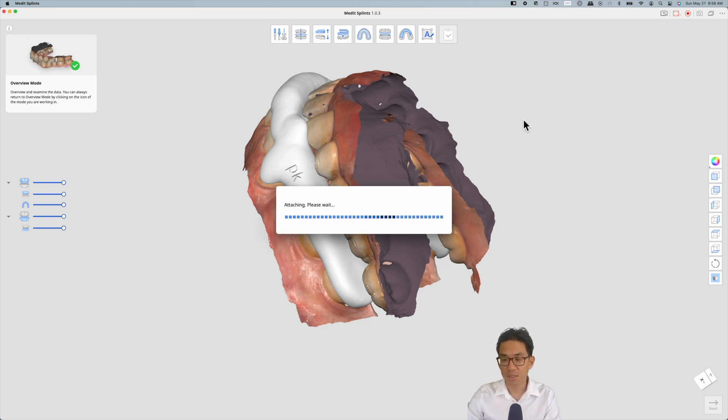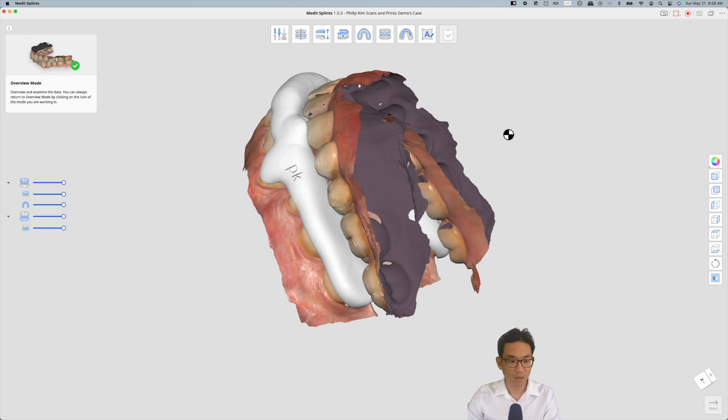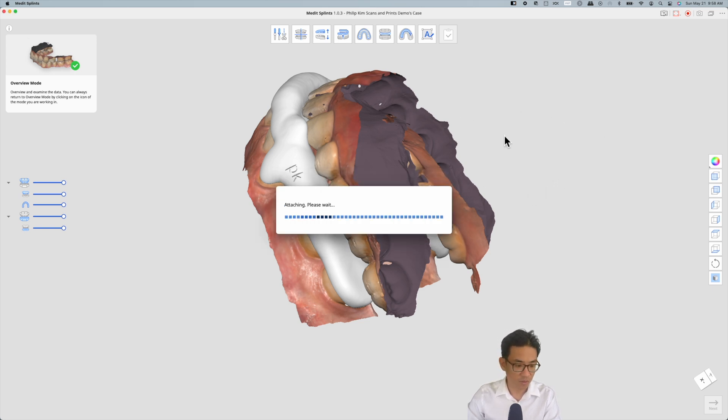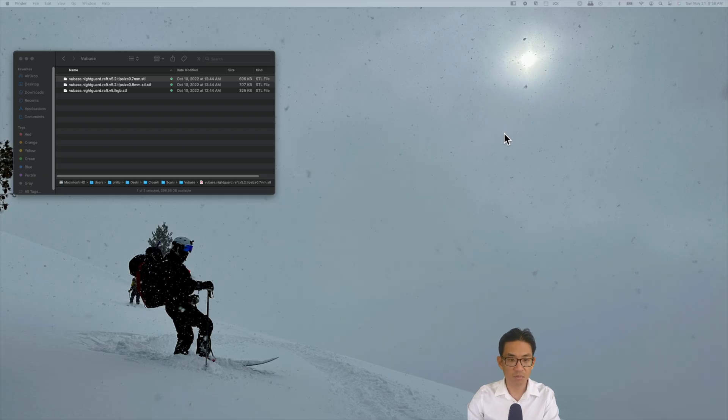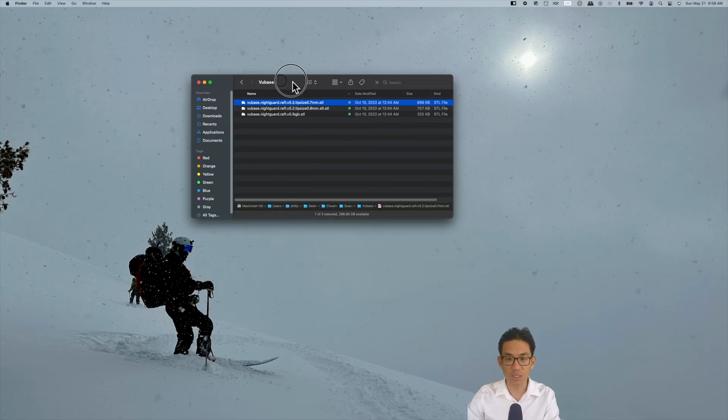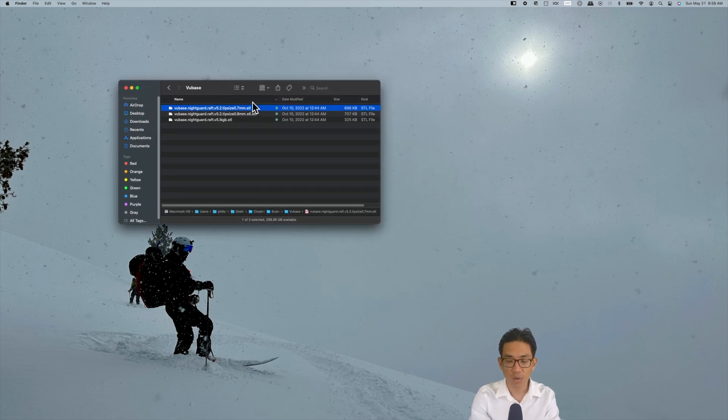Hit next and hit save. This is how long it took to make a night guard, just around 10 minutes, maybe even quicker without all the explanations.